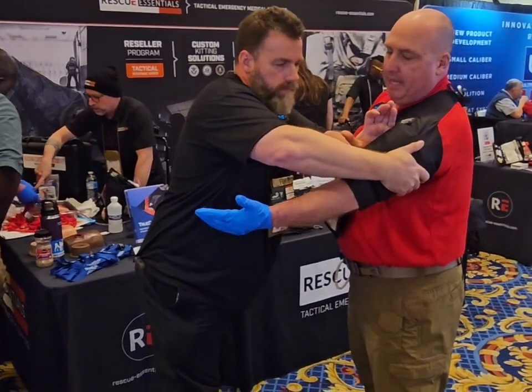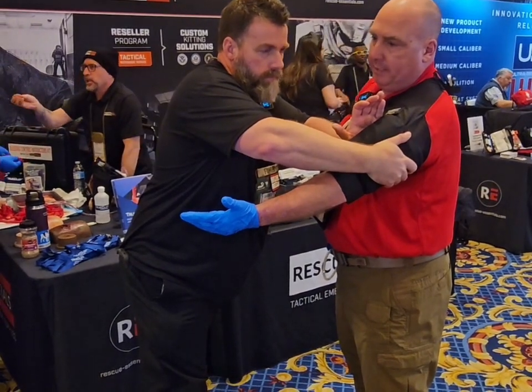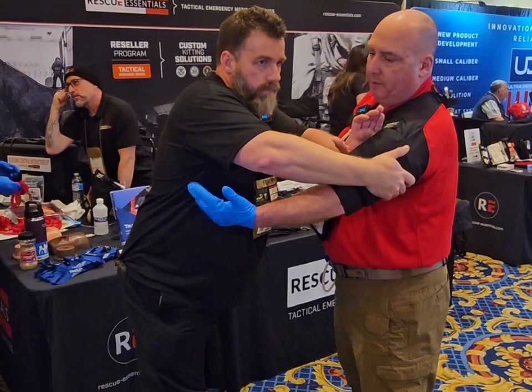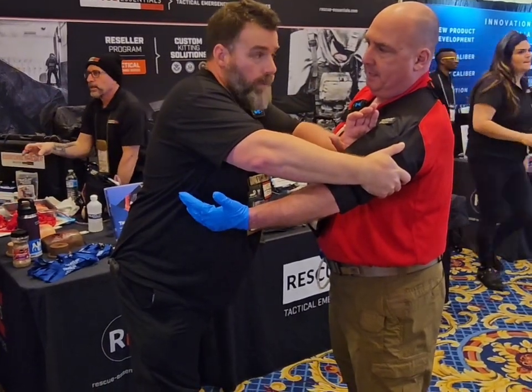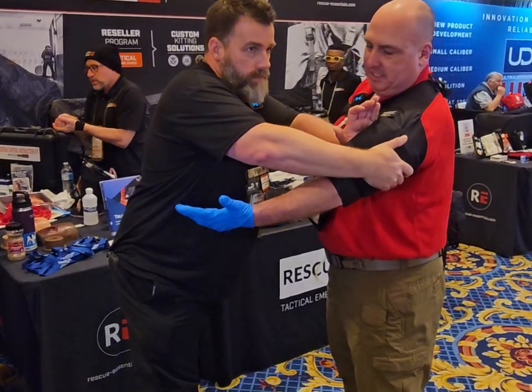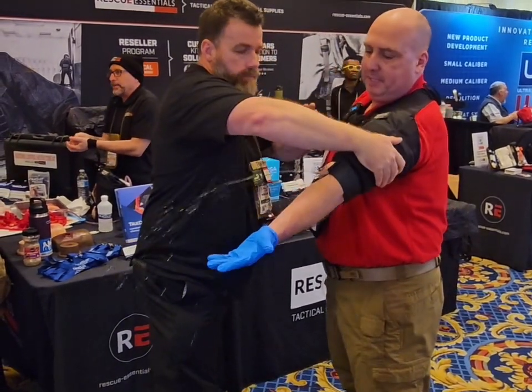If they have it set up for upper extremity single-handed application, it's looped. If they try to loop it through my hand, they're going to have to move my hand with them. We simulate Sam releasing his stance and releasing his hand — and this is what I do to the student, so now they learn that's the wrong way.